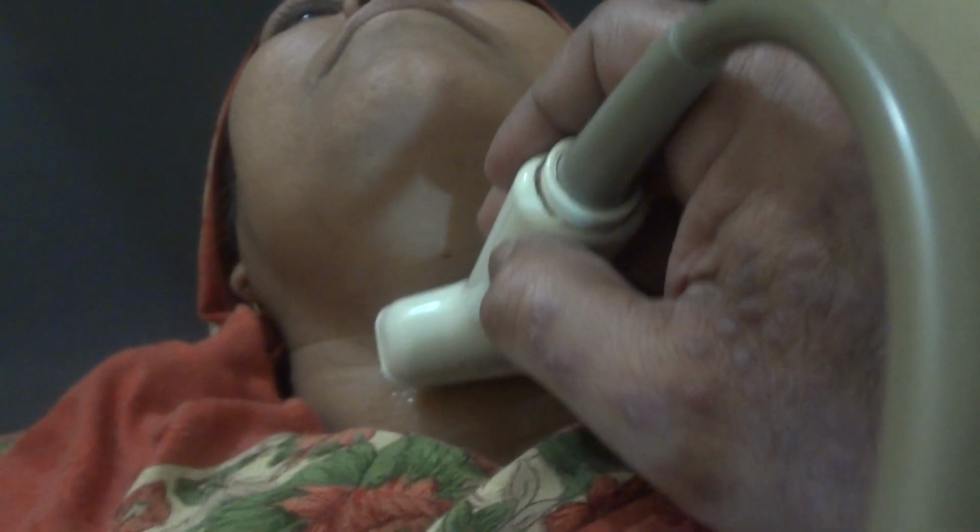Sonography of the thyroid. Extend the patient's neck. You can place a pillow behind the neck of the patient and ask the patient to look upwards towards the ceiling, and place the probe transversely in the center of the neck. So this will be your transverse.